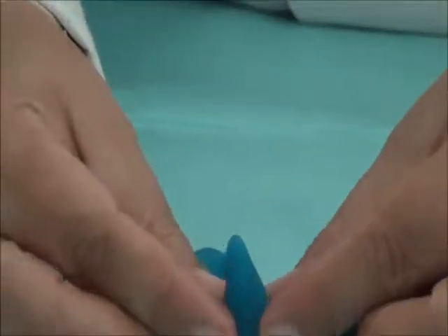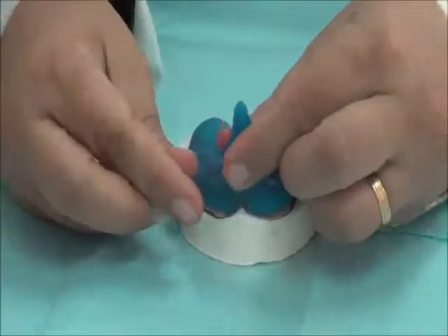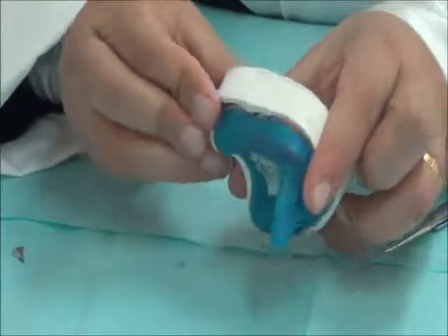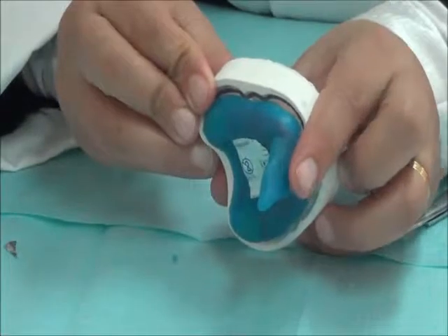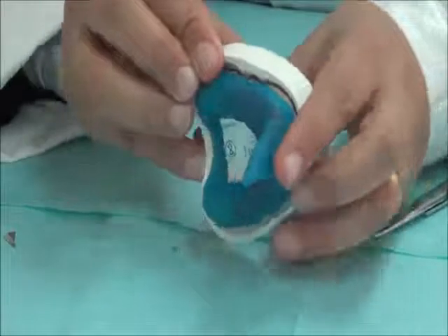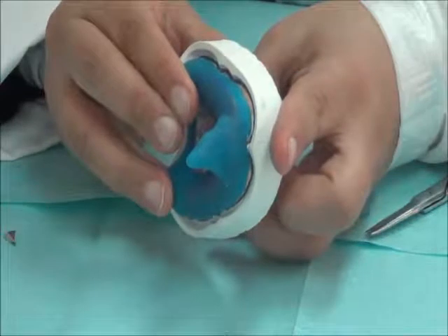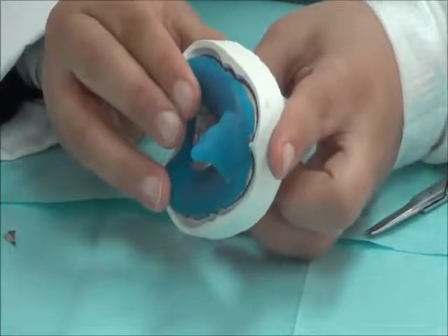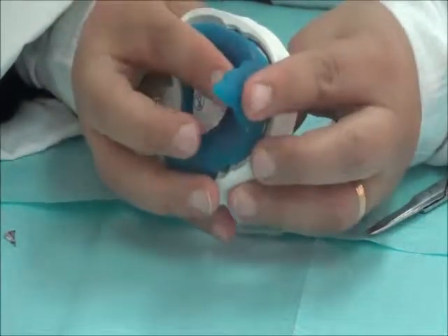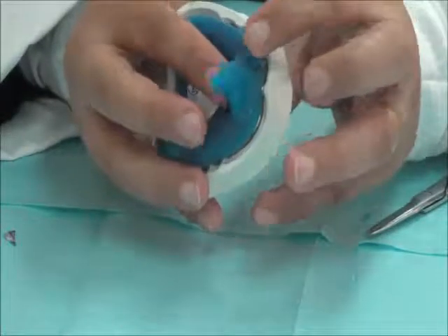Now for this part, we elongate it, and we can put our finger to mimic the lip. We need to make sure that the body of the handle doesn't interfere, because if it was like this, the lip will be pressed away from its location, and thus the sulcus will not be recorded correctly. So we put our finger in the first 2/3 of this to make sure that the lip is not interfered with by the handle.